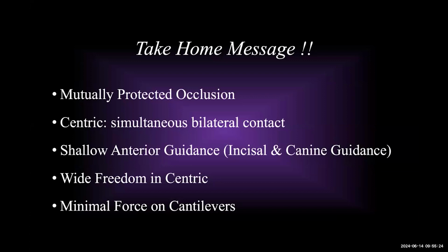Remember, anterior guidance, there's 2 components of that. Incisal, which is protrusive, canine guidance, which is going into lateral excursions. We want, especially in these fixed against fixed cases, we want to make sure that that patient does have the ability to slide into a more comfortable position.